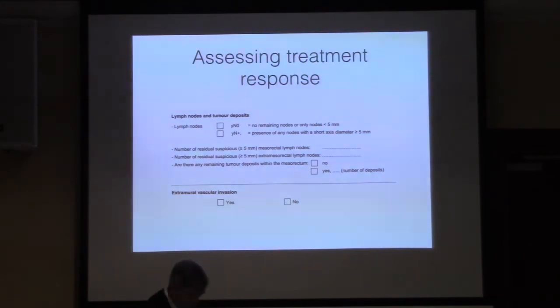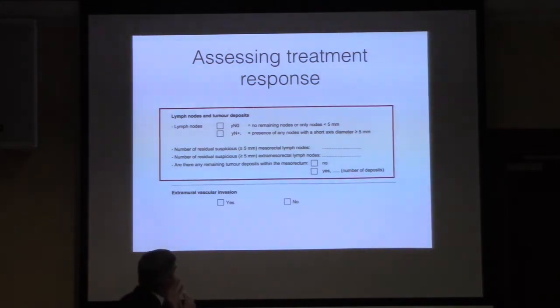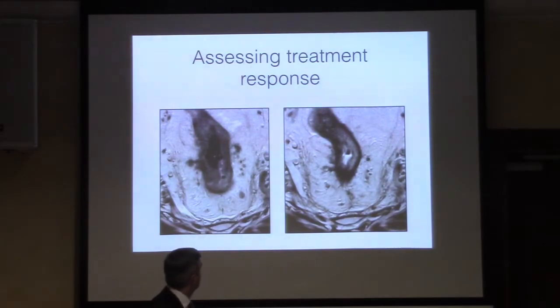And you'll notice that all of the TNM is prefixed with a Y. That denotes they had treatment. So this is a post-treatment evaluation. That's what the Y prefix means. And you should include, again, involvement of the EMVI.